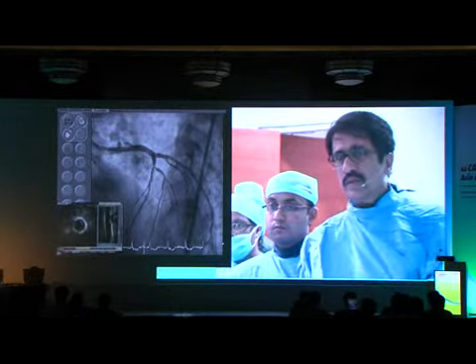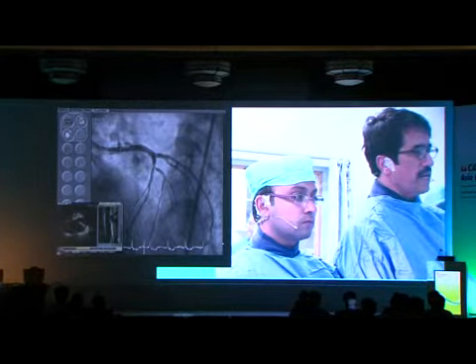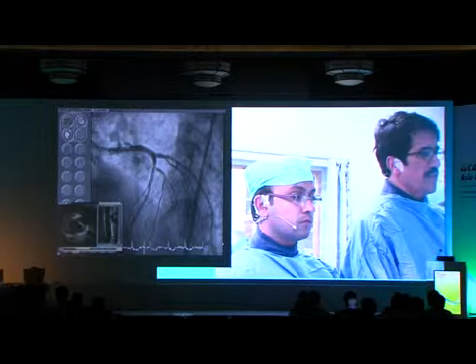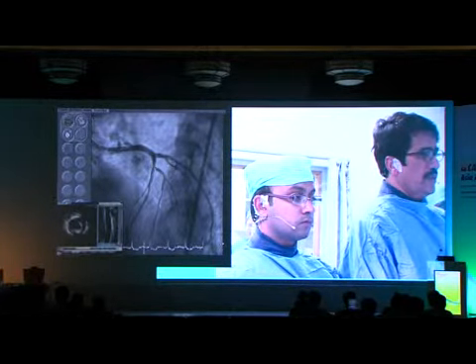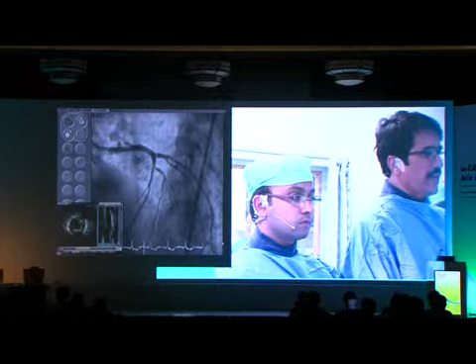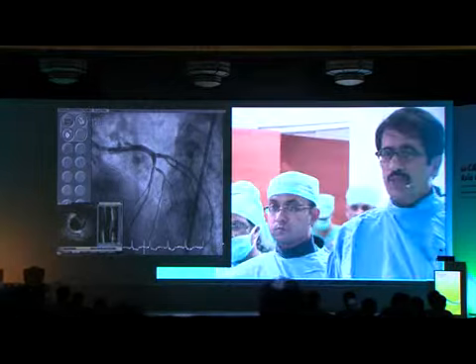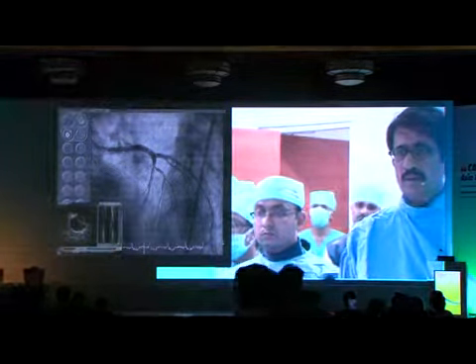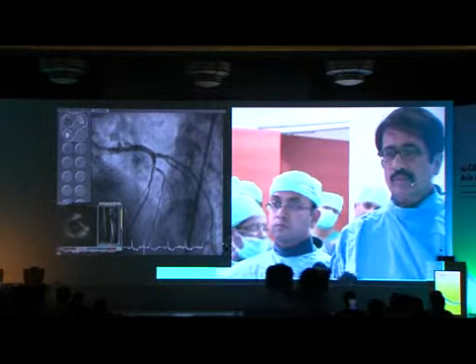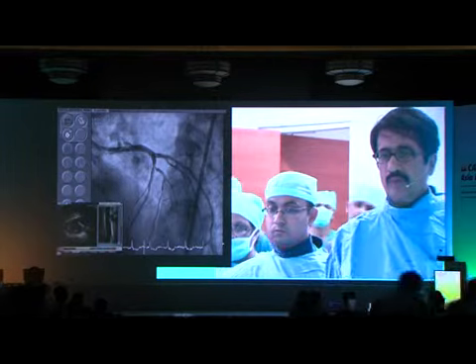And as you can see, this is the diagonal coming up, and you can see sizable atheroma in the LAD, and this is on the back before the origin of diagonal. I'll show it to you one more time, from distal to proximal.